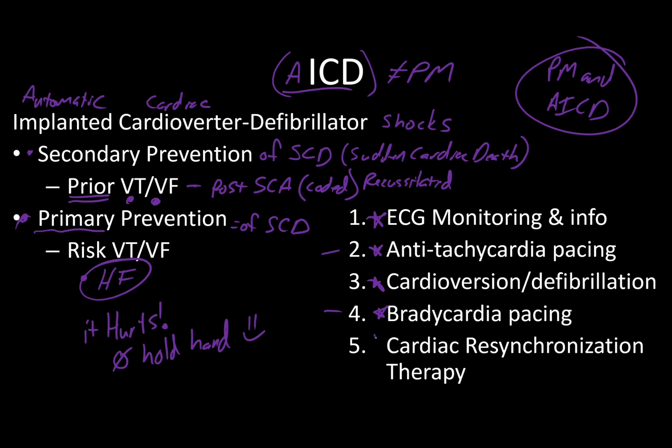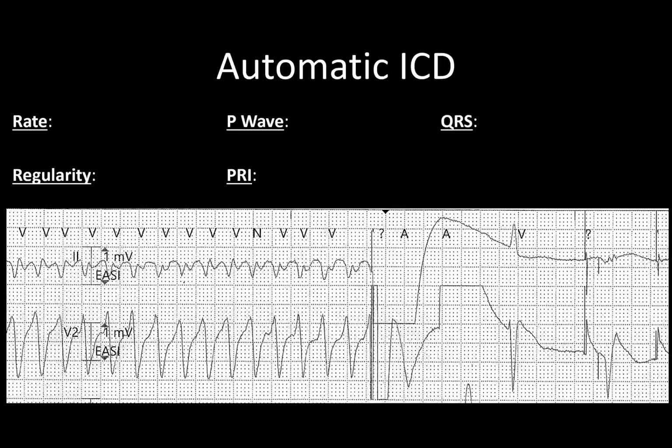Last but not least, and this is for the advanced arrhythmia group, is cardiac resynchronization therapy. That is a high-end pacemaker that also has the AICD mixed in with it, so that it can deliver the pinnacle of what we're capable of doing for patients with very poor heart function. As you can tell after hearing me talk about it on the previous slide, I get pretty excited about these because they are very neat.